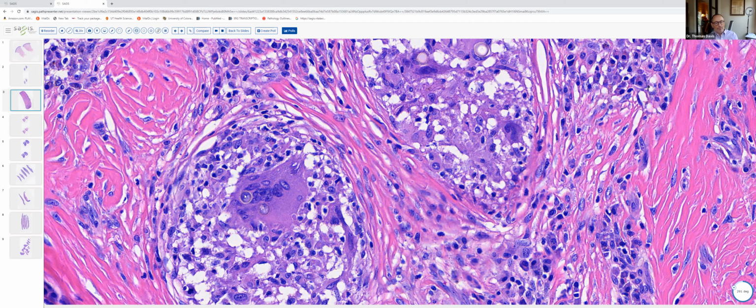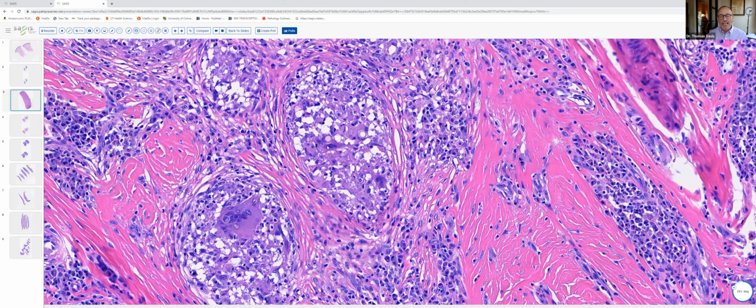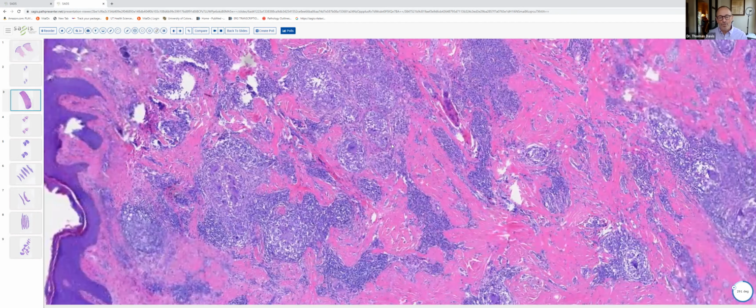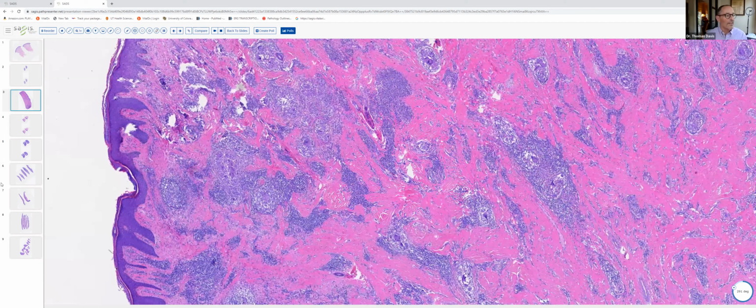so they're extremely big. About the only organism that's bigger than this that one can occasionally see in skin biopsies is rhinosporidiosis, and that tends to occur on mucosal surfaces and is not encountered as frequently. Here's another spherule. We've lost the cytoplasm, but you can see the refractile wall. So this was an example of coccidioidomycosis, which tends to induce a granulomatous response in the skin.